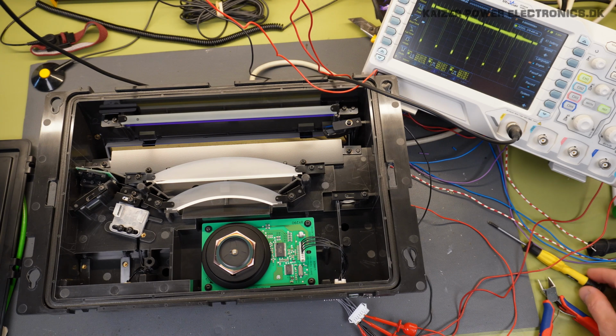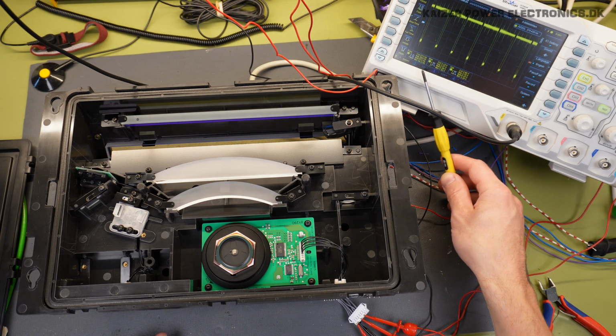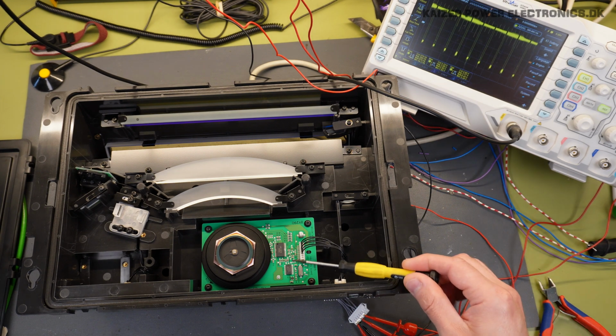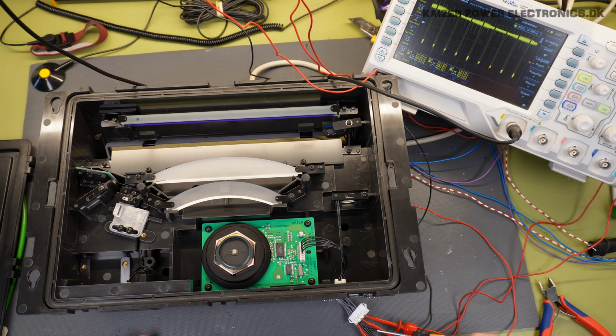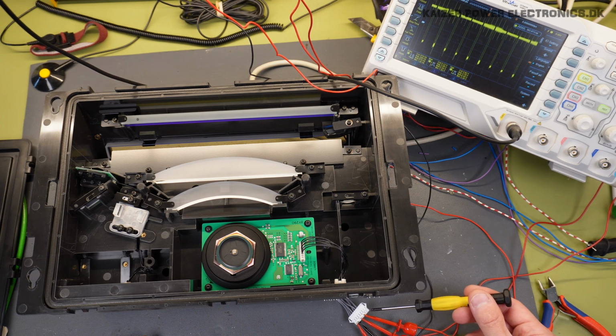All right, so I have my signal generator set for, what's that? Some 200 hertz signal right now. The manual for the driver IC here says it takes a pulse input from 400 hertz to 10,000 hertz, so we'll just start with a low speed input. I have supplied the board with 24 volt DC, and we have a 3 volt DC high input to the start stop of the motor, and then we have our clock pulse input here.